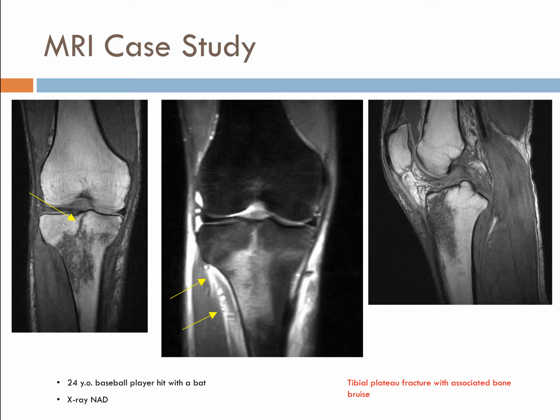That middle image, the STIR image, is a little bit fuzzy because the patient moved throughout the scan. That's the thing too with CT images I was talking to you about, a 10-second scan or a head scan. We can do a volumetric head scan in about a second or so, very fast.